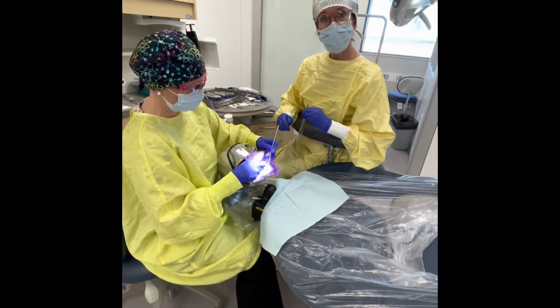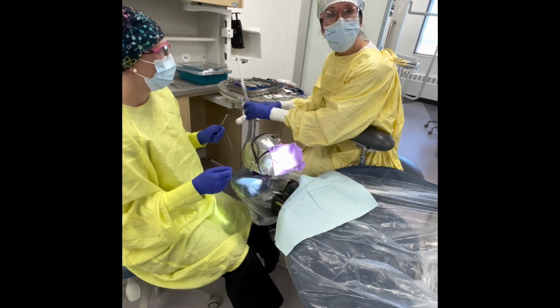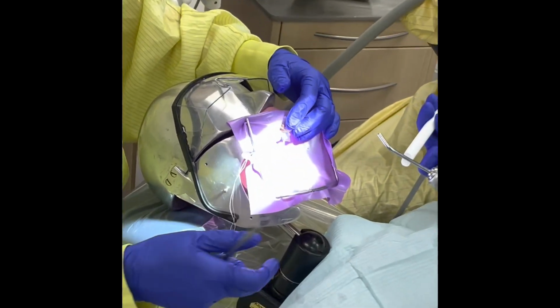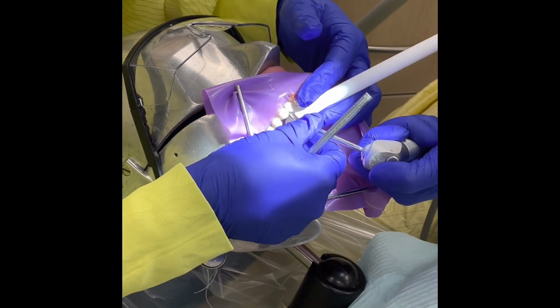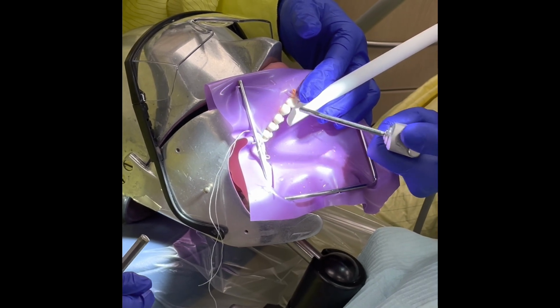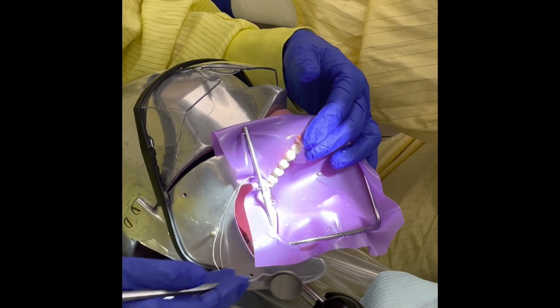Thank you. So what I'll do next is I'll give the prep a good wash, because with Amanda putting that wedge in, there could be a little bit of blood there, and we don't want to put a filling on a tooth that needs to be washed. So she'll hold that strip, and I'll guide her in if needed. And now the tooth is washed and dried. If we don't hold that strip in, sometimes it blows away. Yes. So we want to make sure we hold it in place.